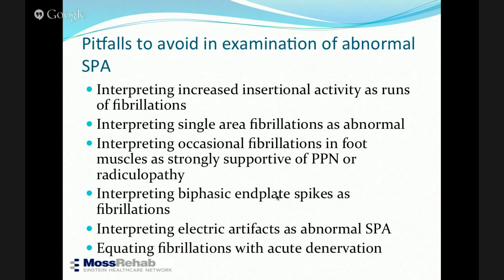However, the rate of firing is very fast in end plate spikes, number one. Number two, it is always associated with the seashell noise. In fibrillations, you don't have that. Number three, the initial deflection in a fibrillation is always positive. Positive in electrodiagnostic term is down. In end plate spike, it's always negative.